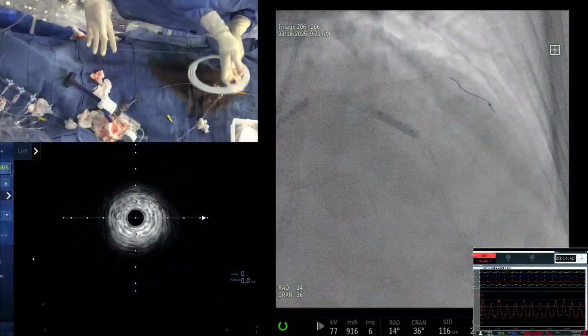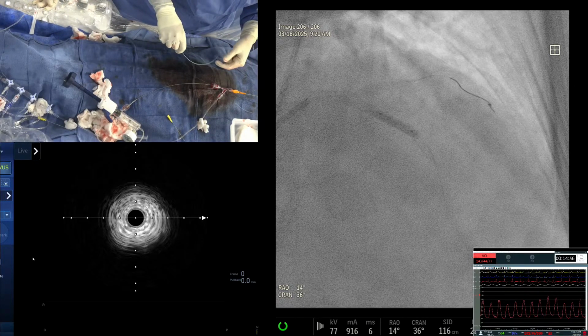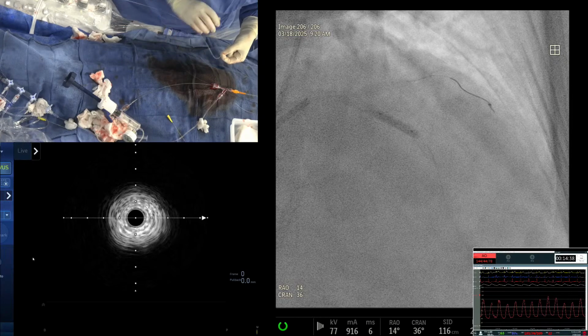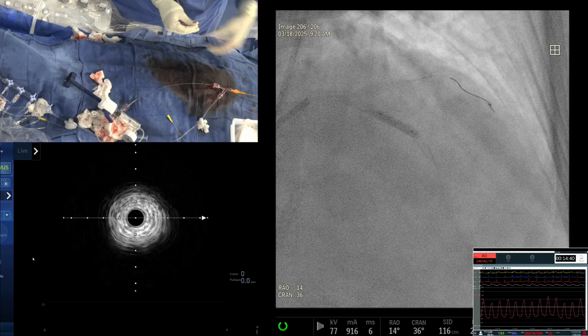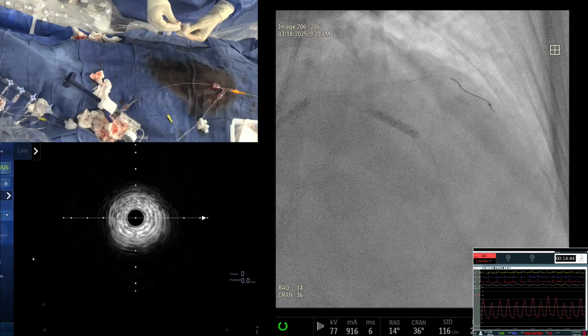So now we can ask Dr. Keeney, where are we now? You want to just show? I like the guidelines. Yeah, saying that you have to use imaging for optimization and all that, but nothing can beat the experience. I was very clear.